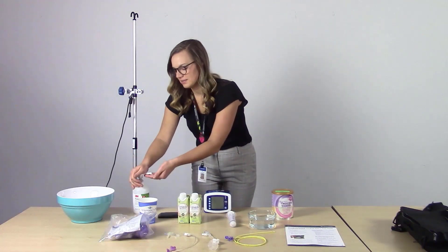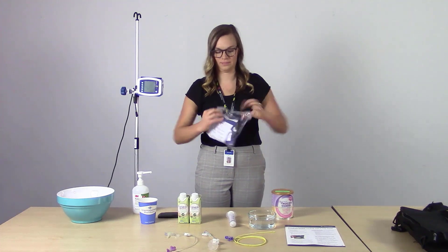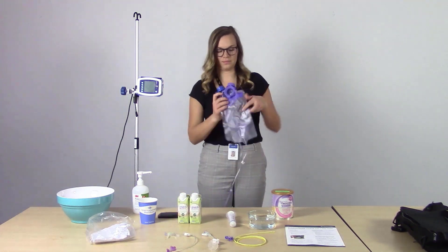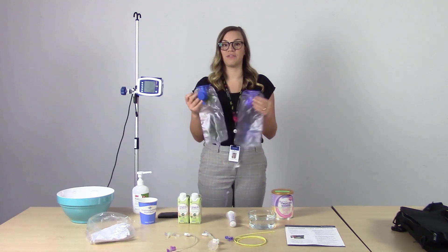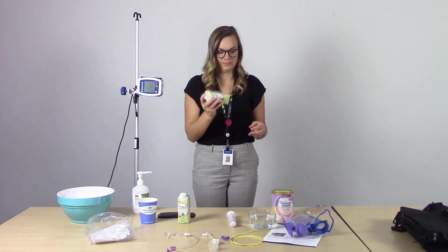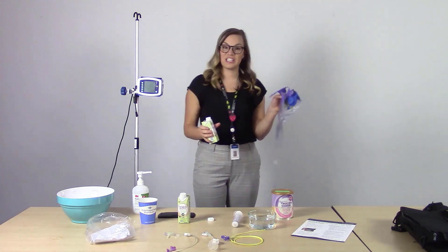First, wash or sanitize your hands. We're going to fill the Feed and Flush Bag Set. The purple bag is for the formula or the Feed, and the blue bag is going to be for the water or the flush. Start by shaking up the formula, opening it up, and pouring it into the feeding bag.